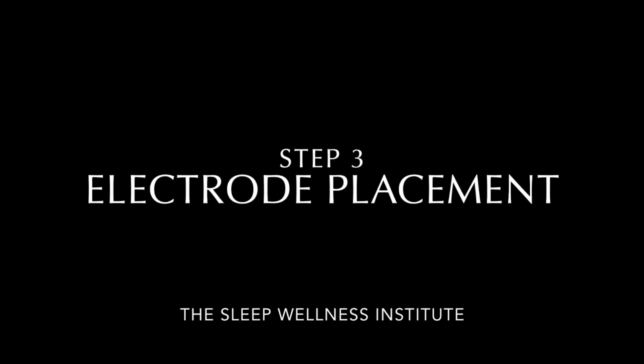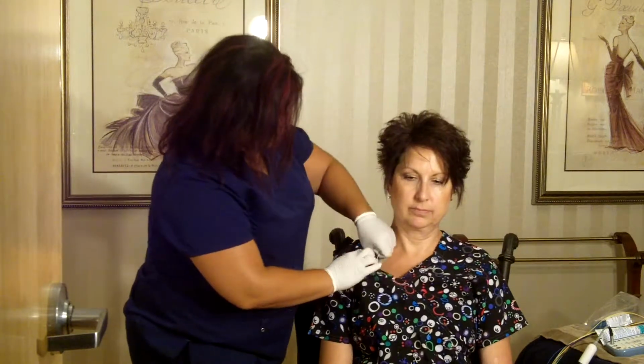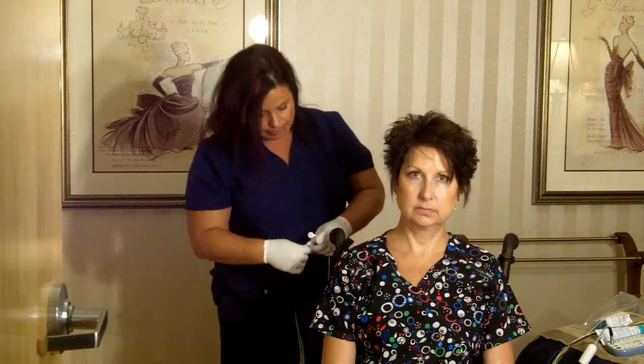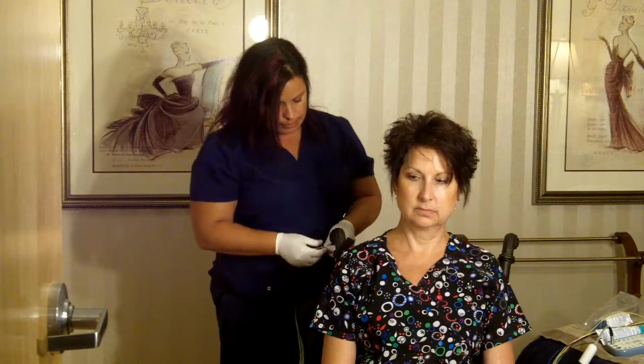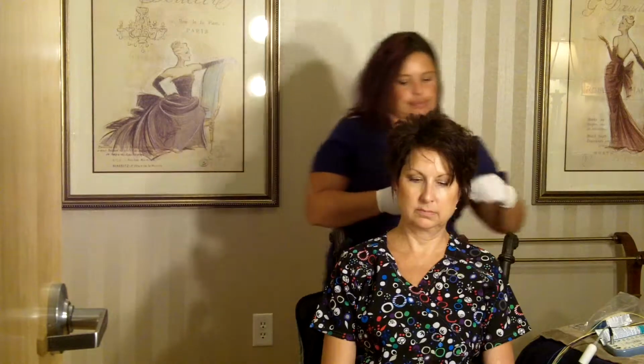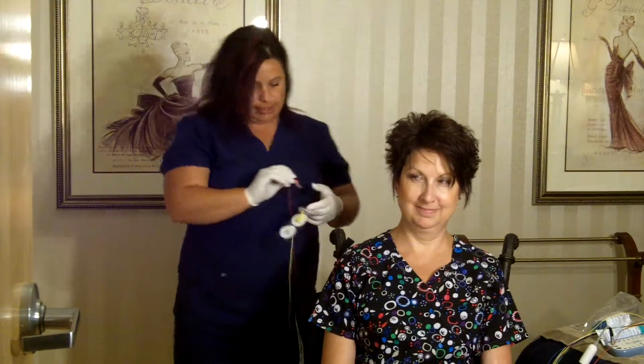Step 3. The final phase of the setup begins. Mindy will first place patches on Kayla's chest. These patches are connected to an EKG, which is used to measure the heart rate and to check for any heart arrhythmia or abnormalities. She will also place them on Kayla's legs to monitor leg movement.